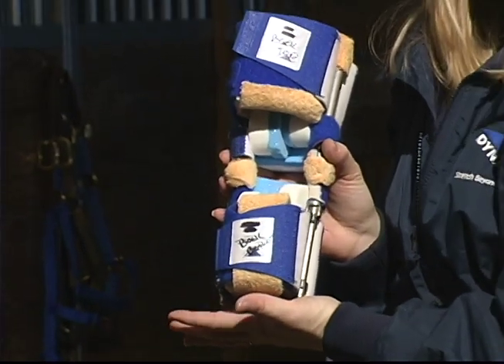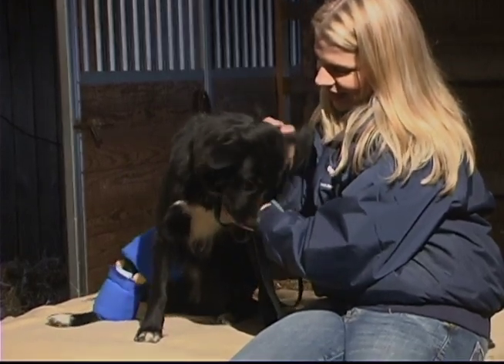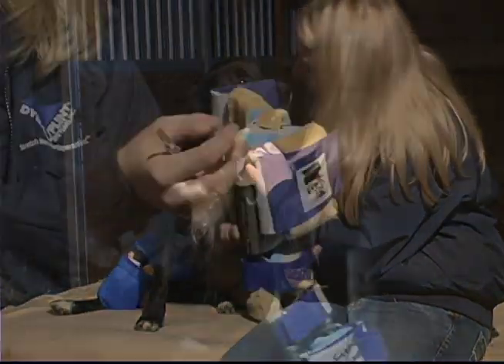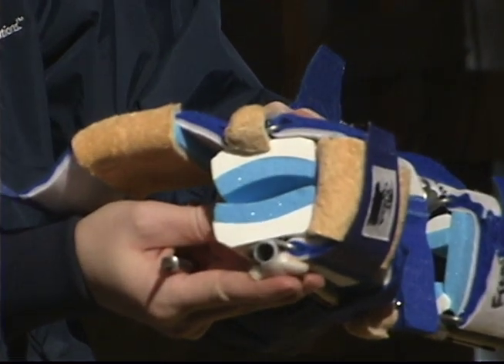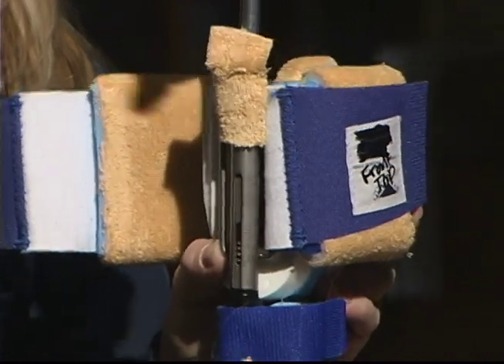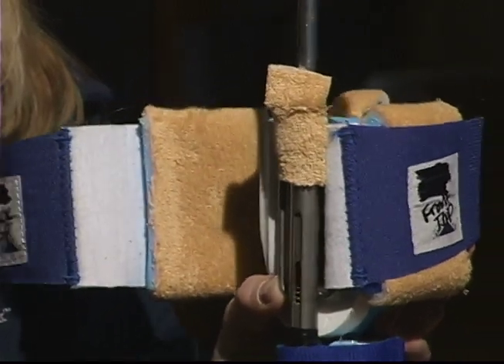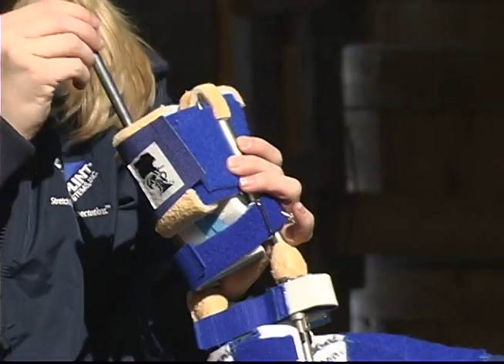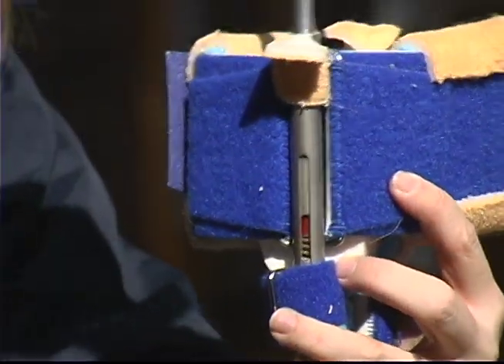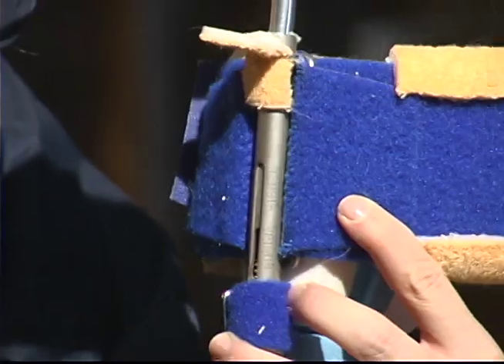Your Dynasplint consultant has preset the initial tension on your dog's splint. If, and only if, the individualized treatment schedule calls for increasing the tension, it is done in the following manner. Insert the silver screwdriver into the hollow end of the proximal strut. To increase tension, turn the screwdriver to the right — righty-tighty. To decrease tension, turn the screwdriver to the left — lefty-loosey. Because the Dynasplint system is a bilateral tensioning device, what you do to one side you must do to the other. The window with the red or blue scales on the distal strut shows the tensioning setting — be sure they match.